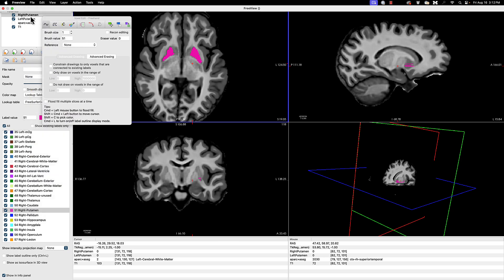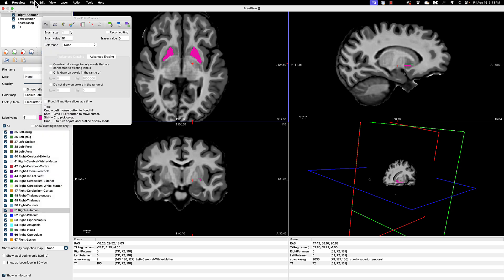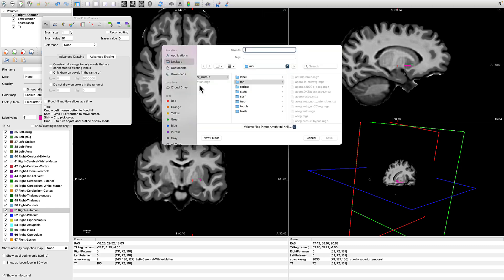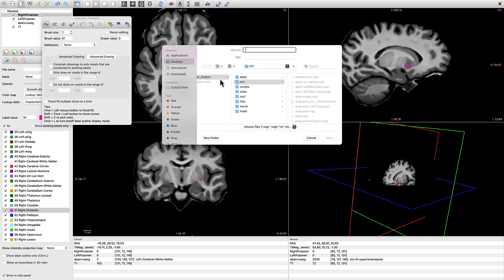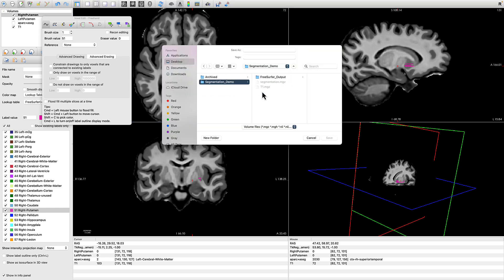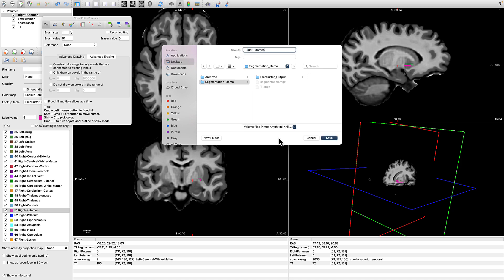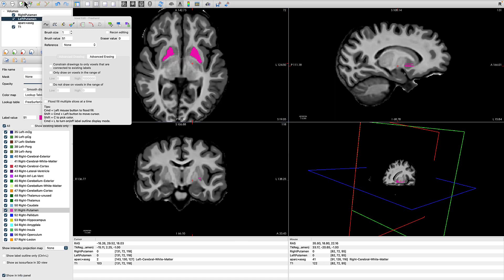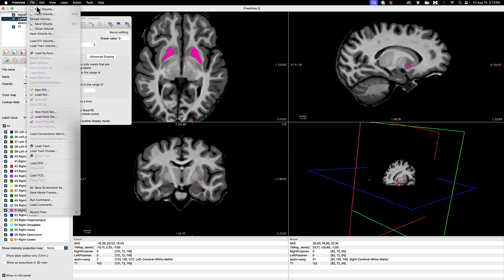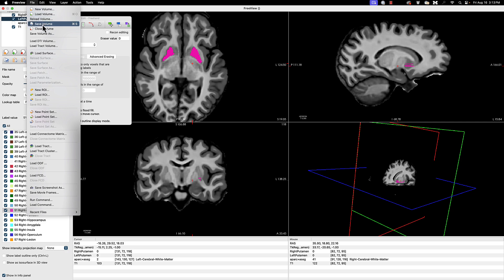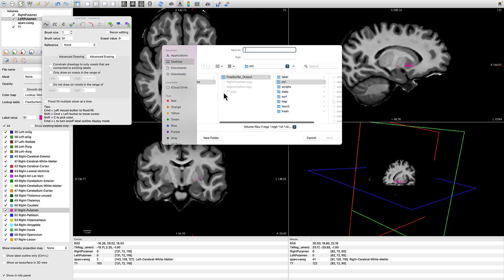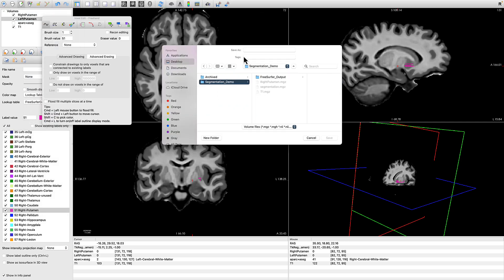I want to show you also how to save out these volumes. So click on file, whatever is highlighted in the volumes bar, in this case right putamen, is going to be saved out. I'm going to put this in my segmentation demo folder, call it right putamen, and by default it will be saved as a .mgz file. I do this for left putamen as well by highlighting it, going to file, save volume, save it in the same directory, and let's call it left putamen.